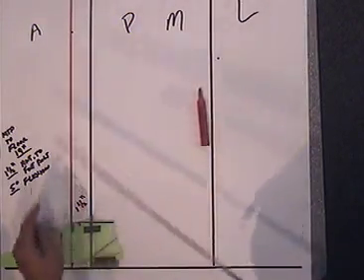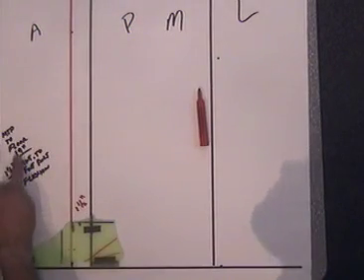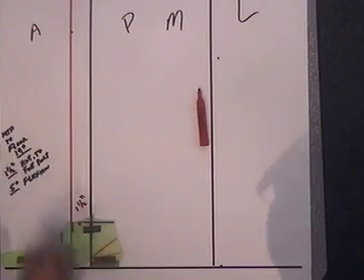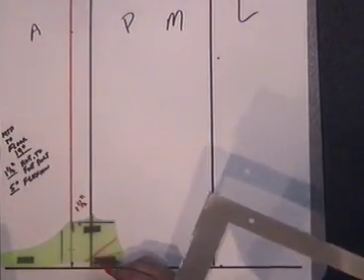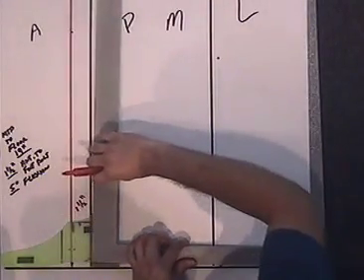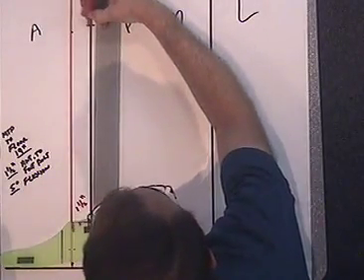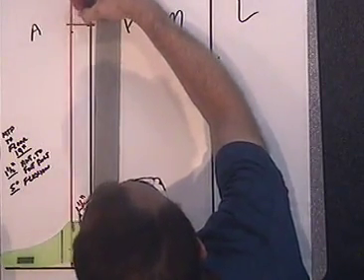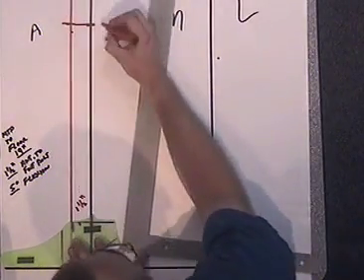And now I need to figure out my height, and the practitioner has written down over here that the MTP to floor is 19 inches. So I'm going to measure up, not from the floor, but from the bottom of the heel, 19 inches. I'm going to take my ruler here, measure up 19 inches. So that's going to be the MTP level.